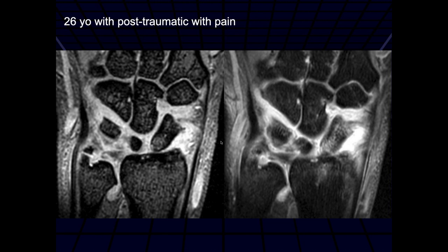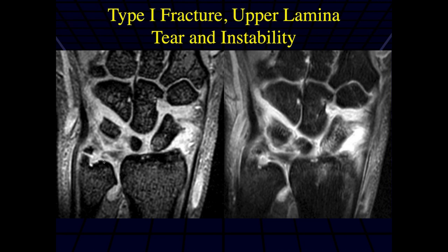We can see a lot of fluid going into the distal radial ulnar joint space — really a separation there. This was a fracture. This one is unstable. Even though it's a distal fracture of the ulnar styloid, it's unstable because the upper lamina is also torn. If the upper lamina were intact, this would be a more stable fracture.